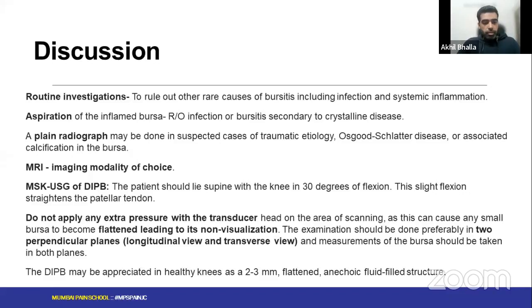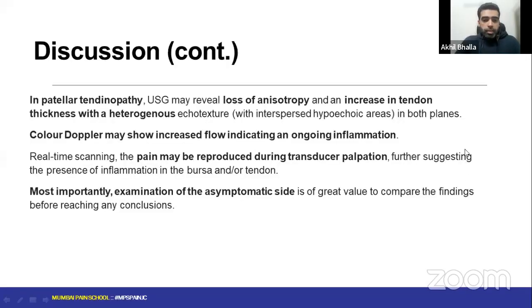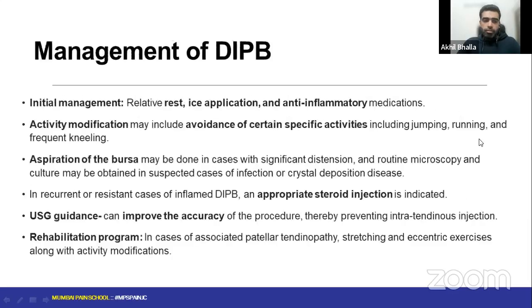The infrapatellar bursa is appreciated in a healthy knee as a 2 to 3 mm flattened and anechoic fluid-filled structure. In patellotendinopathy, what you will see on a musculoskeletal ultrasound is a loss of anisotropy of the tendon and an increase in the tendon thickness with a heterogeneous echo texture, as was shown in this paper as well. Color Doppler may show increased flow, indicating an ongoing inflammation. On a real-time scan, the pain may be reproduced during transducer palpation. And most importantly, always go for an examination of the asymptomatic side to compare the results before reaching any conclusion.